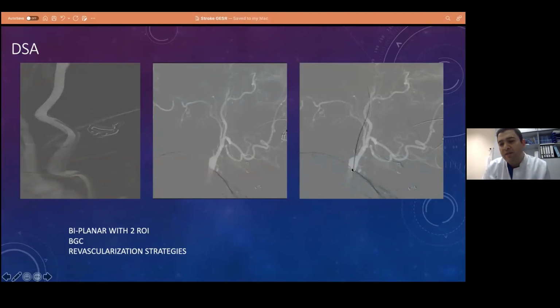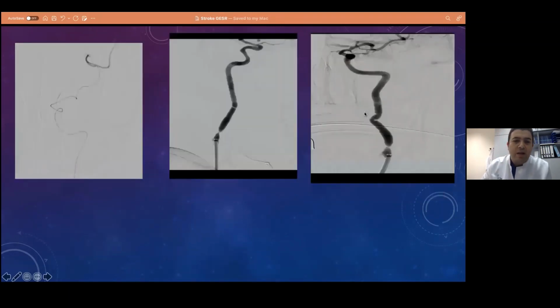We passed this thrombosed vessel with a Terumo guide wire, and after that we got through our balloon-guided catheter, a microcatheter. We always do an injection over the microcatheter to be sure that you are still inside the middle cerebral artery branch, M2 segment, for example.